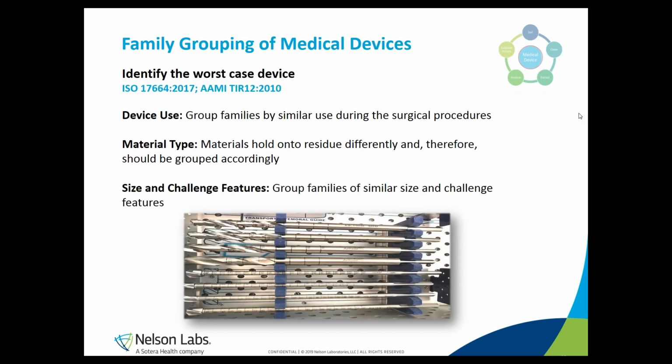We frequently get questioned by medical device manufacturers whether they have to validate a full processing cycle for each and every device design that is produced. And I can comfort you that the answer is no. It's not always necessary. And I will explain this with a little example.